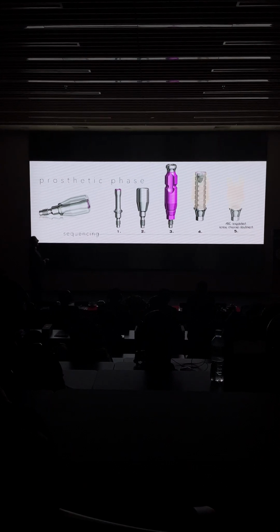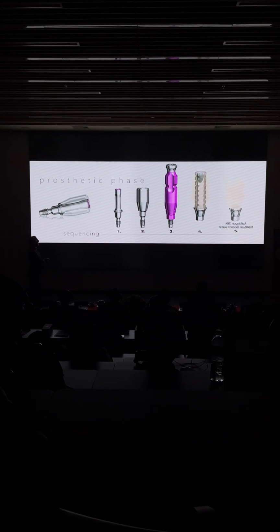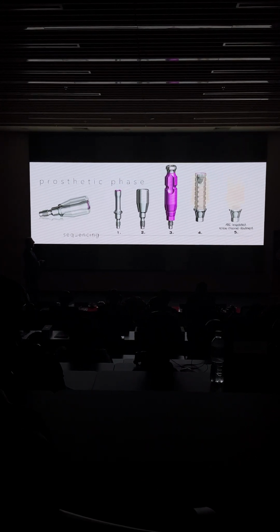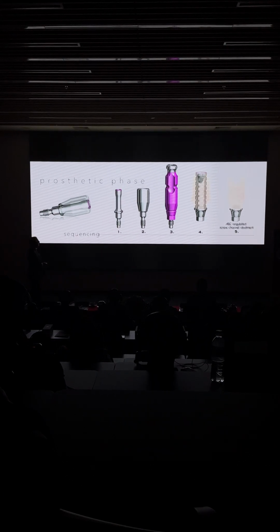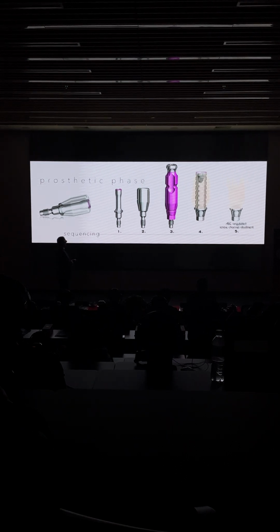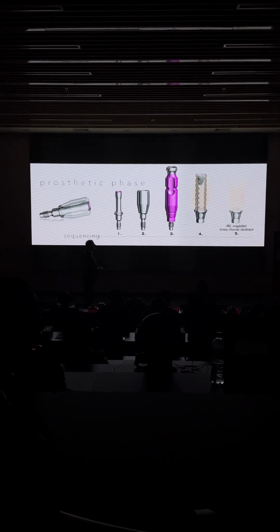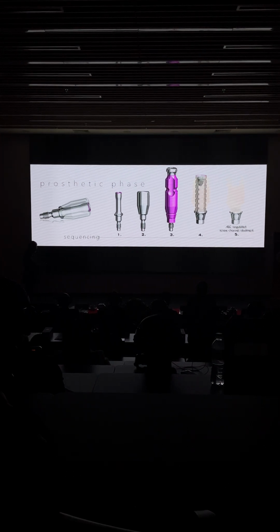And then you can jump from this slim healing abutment, surgical healing abutment, to a prosthetic one. You can use customize, wider, it depends what you prefer, or your prosthodontist prefers. And then you use an impression coping that has the same diameter as your healing abutment. And then you can go through a provisional abutment and to a final zirconia abutment, either screw retain or cement retain.